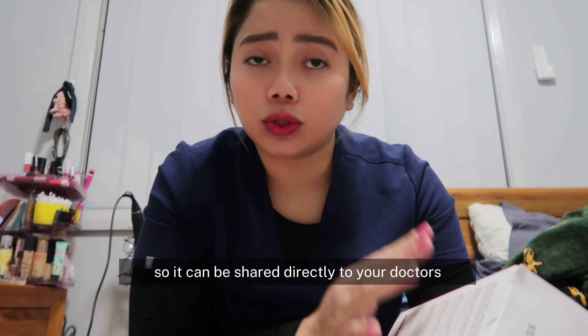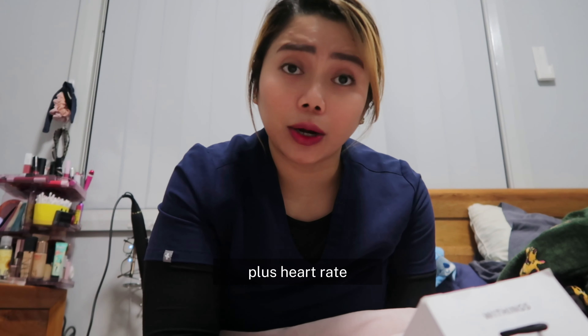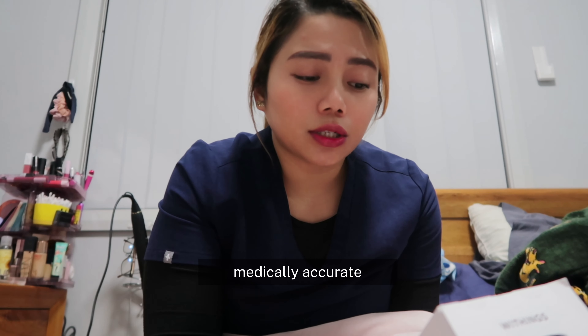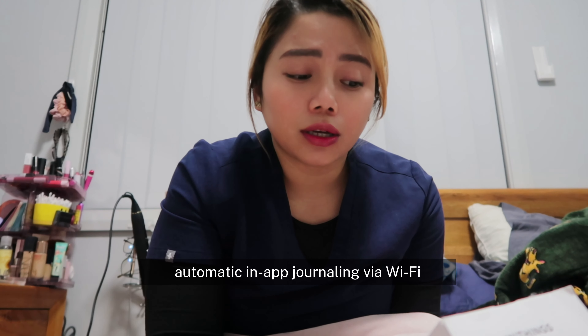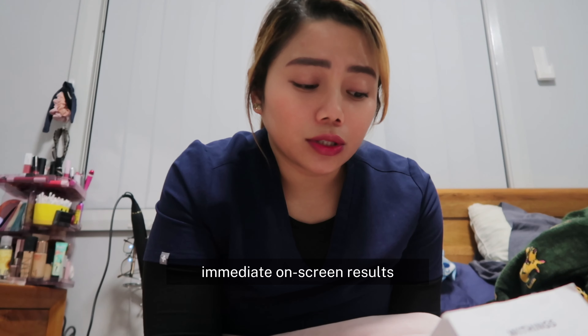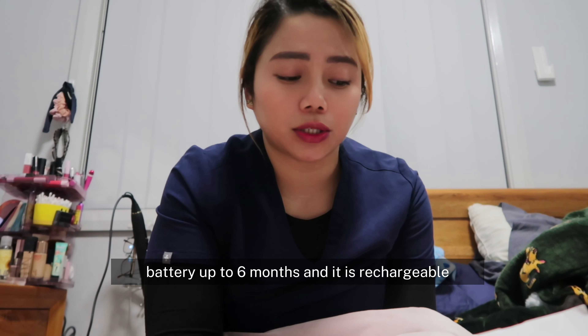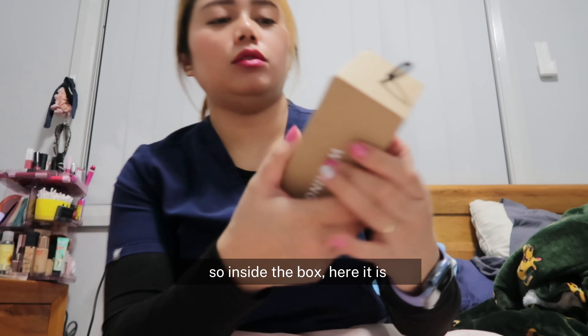It can be shared directly to your doctors. It measures systolic and diastolic blood pressure plus heart rate — medically accurate, automatic in-app journaling via Wi-Fi, immediate on-screen results, multi-user support for up to eight users, battery life up to six months, and it is rechargeable.